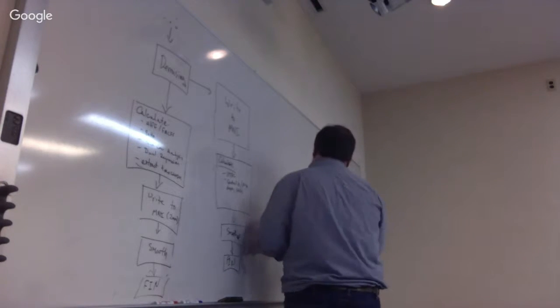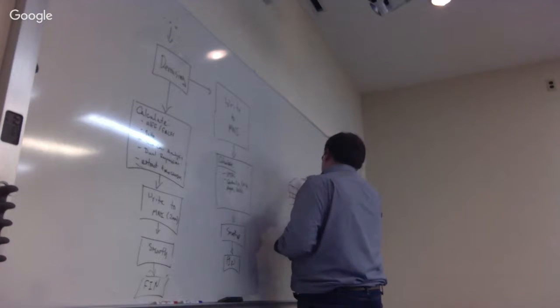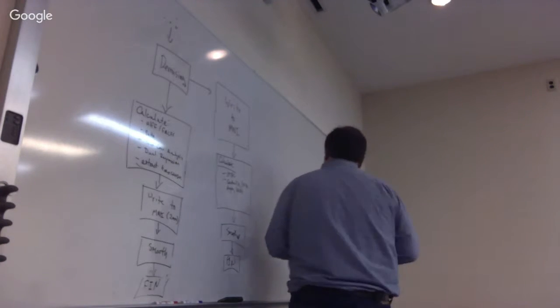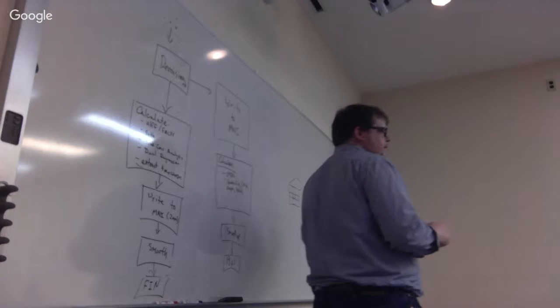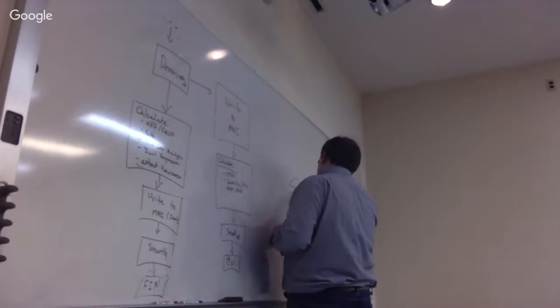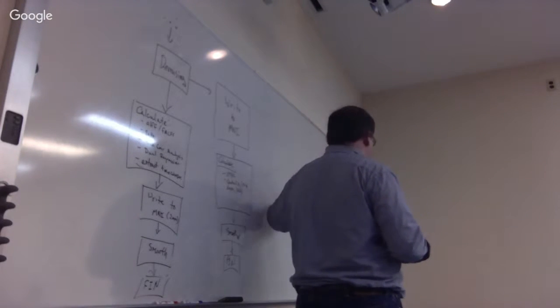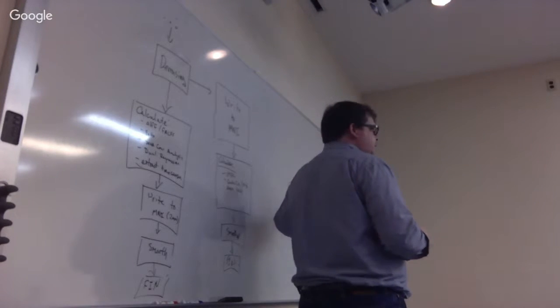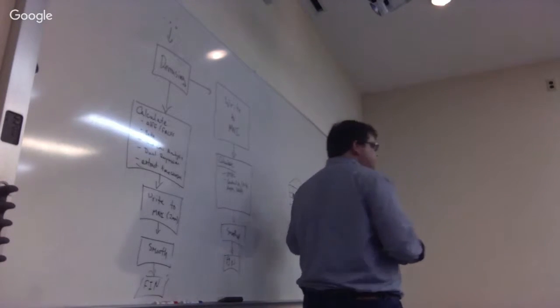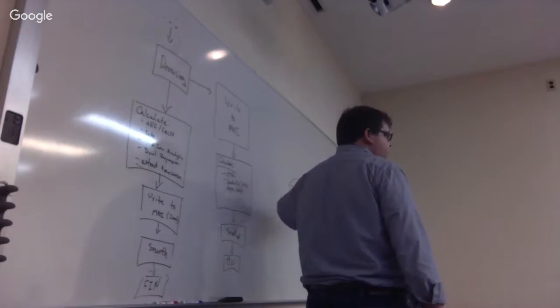For those of you who may not know, with ReHo, what you have is, say, let's see if I can draw a cube here. You have your Rubik's cube that's the brain, right? So you have a 3x3 region, and what you do is you calculate the correlation between the center voxel and all of the voxels on the outside of that cube, right? And we can change it. So this is a 27 cube, right? So there's 27 voxels that you do the calculation on.